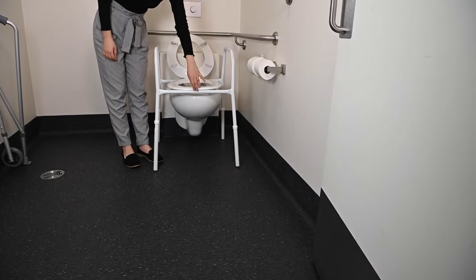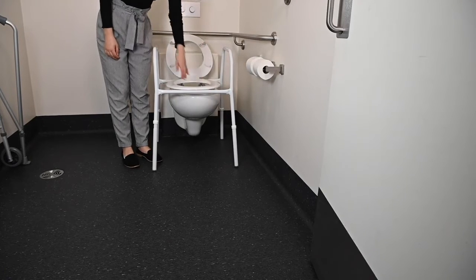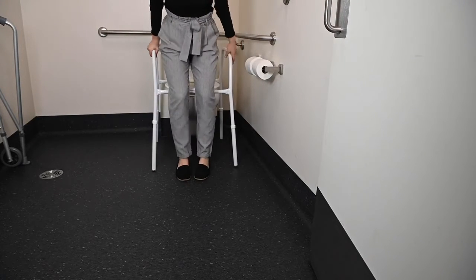To transfer on and off safely, please ensure equal force is applied through both armrests to avoid the toilet frame from tipping.